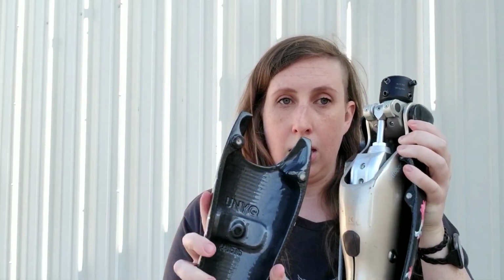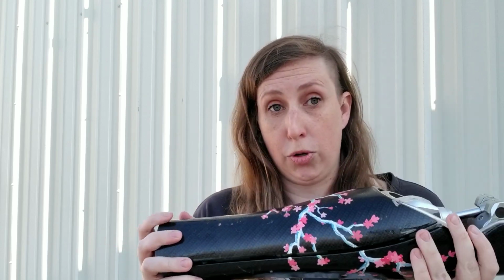And then it actually has magnetic pieces in it so that you can take it off. This is actually a lot nicer because all you have to do is unscrew these pieces, and then you can take the whole entire cover off if you need to. And then the magnetic pieces are really great because it's super strong.